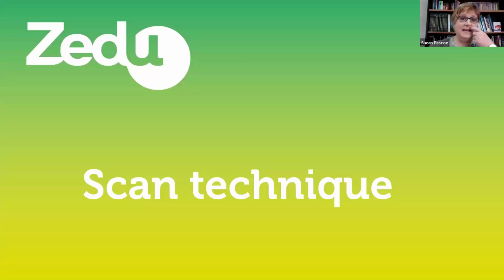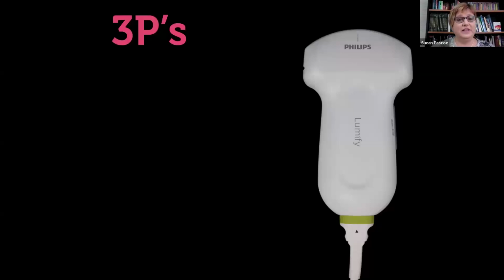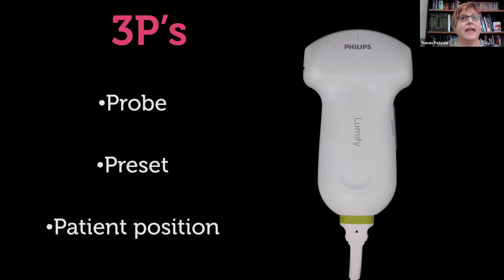So let's look at the scanning technique. And the first thing we need to think about, as always with anything we're doing, is what are the 3 Ps? We're first going to pick the right probe. And in this case, we want to use the curved probe, choose an abdominal preset, and we want to position the patient supine on the table. Now, there are some techniques to help visualize the pancreas that we'll go into in a bit, where you stand the patient up, and that can help you move the gas in the stomach and the transverse colon so that you get clearer visualization of the pancreas.